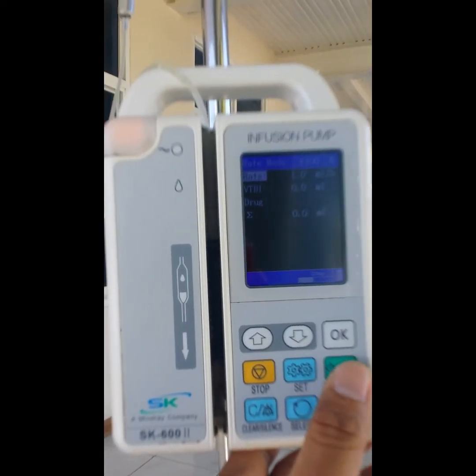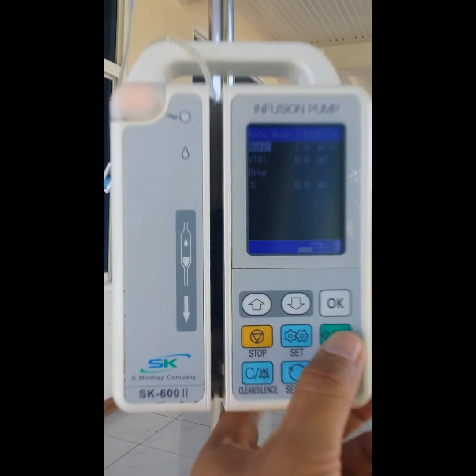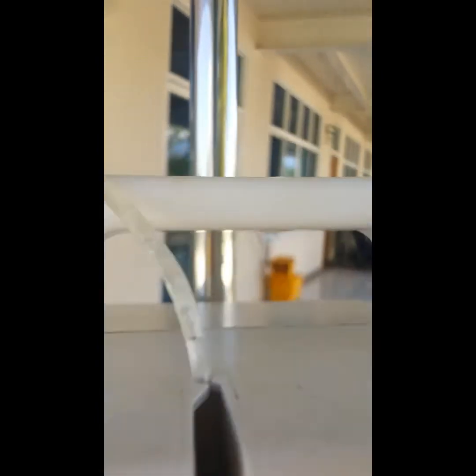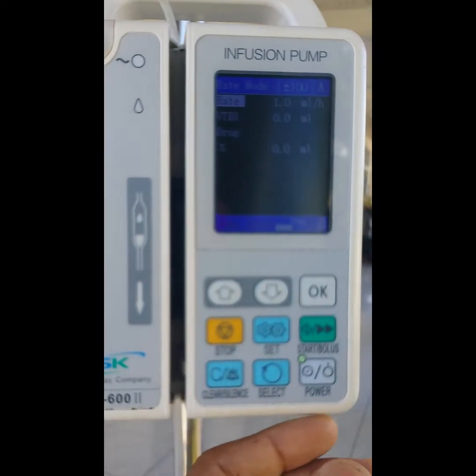Good day. I have here another infusion pump from SK — again, the SK 6060. The problem with this one is there's an error tube indicator. I did check the tubings and they're intact, meaning I think the ultrasonic sensor did not recognize the tube. So we're going to check it — I'm going to open it up.